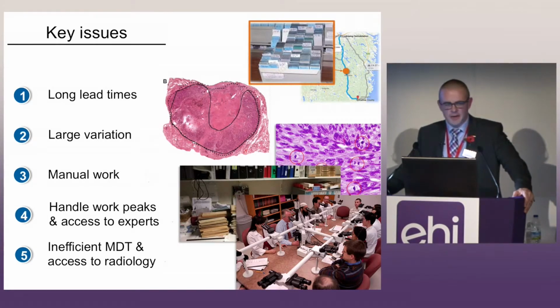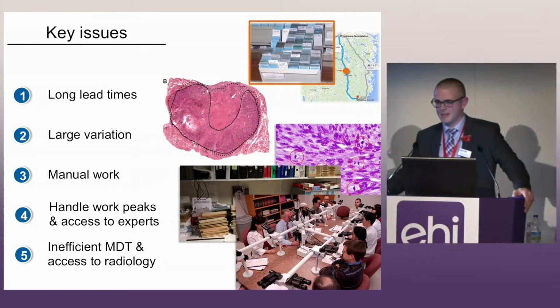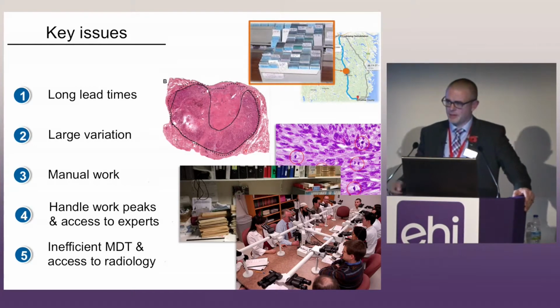Radiologists are already very used to preparing cases, getting the slides ready for immediate discussion in the MDT meeting. The pathologist, on the other hand, typically has to take the slides out of the bag, put it onto the microscope, find the area in question, by which time the group may have already moved on to the next patient.